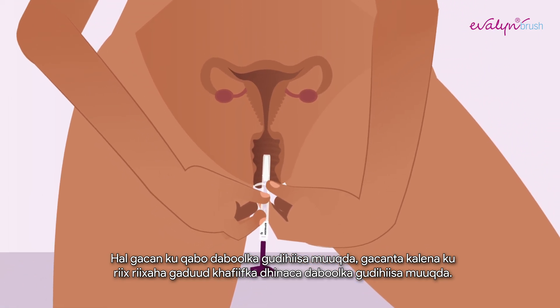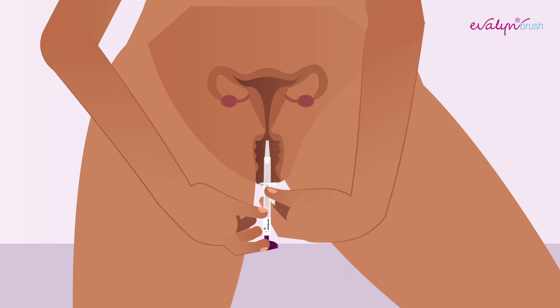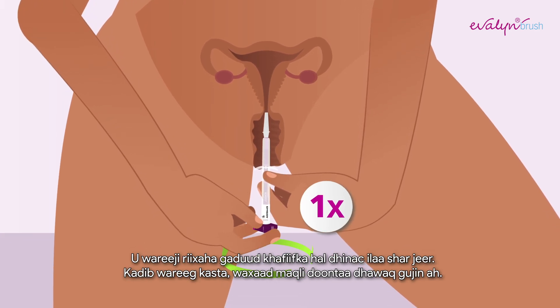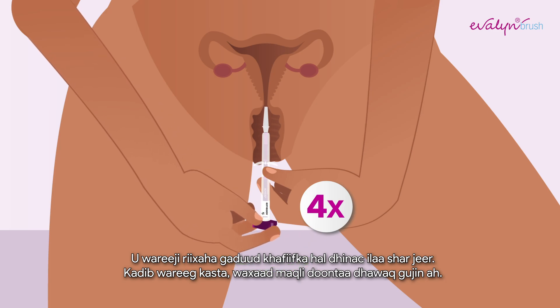Hold the transparent casing with one hand and with your other hand, push the pink plunger in the direction of the transparent casing. You will hear and feel a click when the brush is in the right position. Turn the pink plunger five rotations in the same direction. After each rotation, you will hear a click.